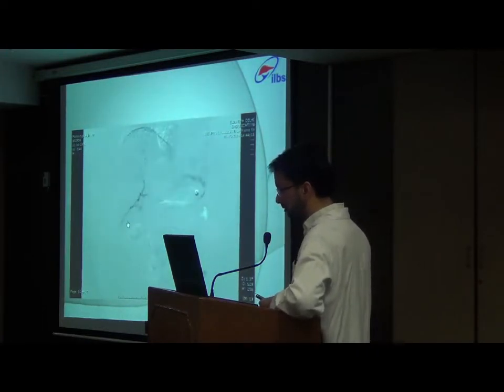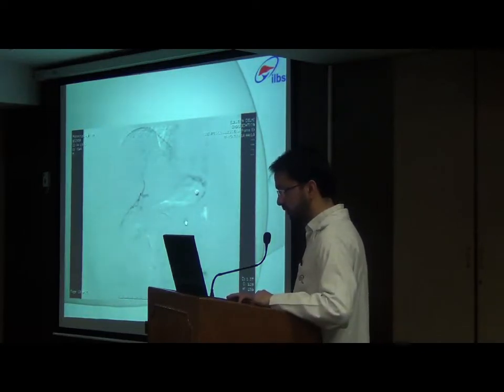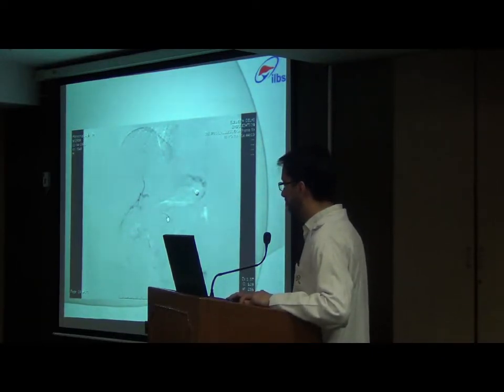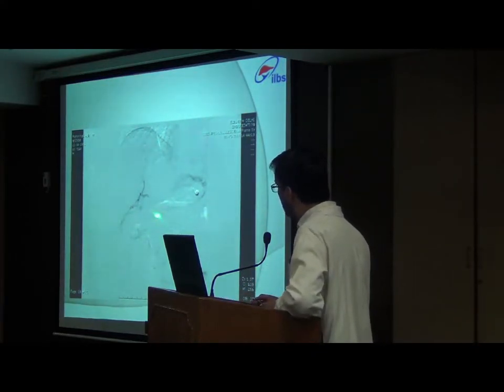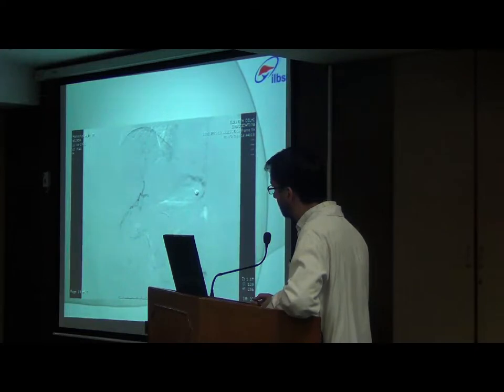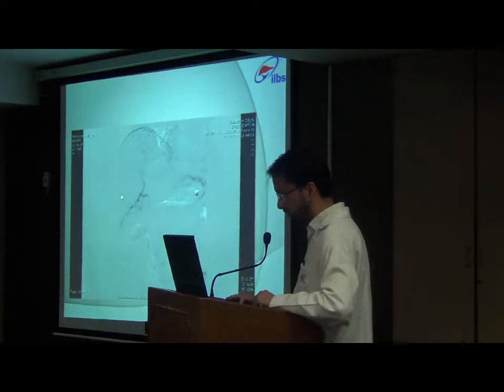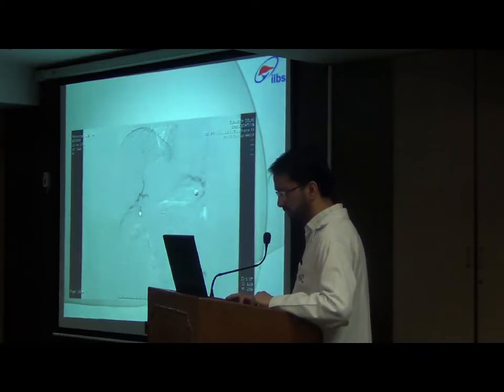This is the initial subtraction angiogram. We are able to see that the catheter has been navigated right from the celiac axis up to the hepatic artery proper. Beyond hepatic artery proper, the microcatheter is passed right into the right hepatic artery, and a contrast run has been taken right at the start of the right hepatic artery, shown in the anterior and the posterior branch. Also note that there is small contrast filling around a globular structure — this is the pseudoaneurysm.